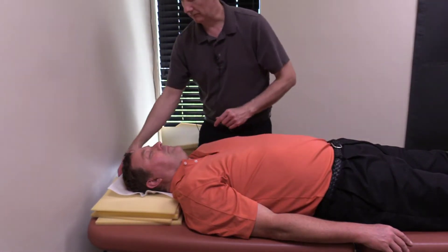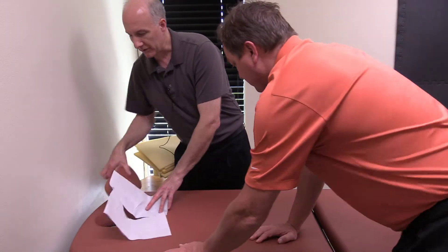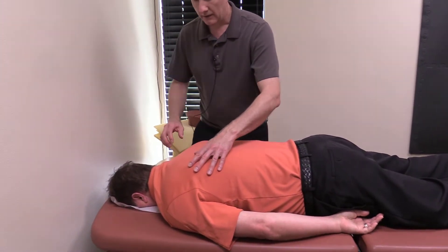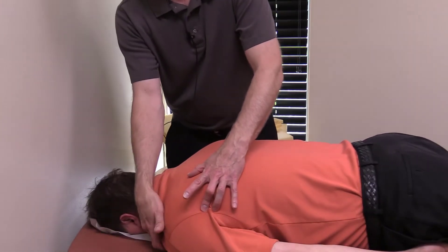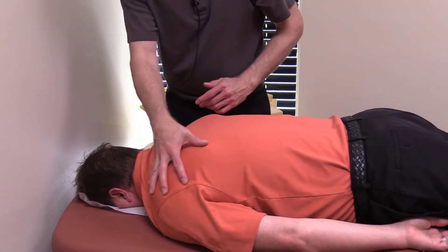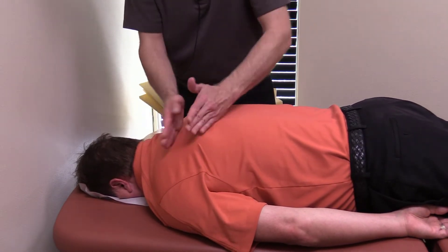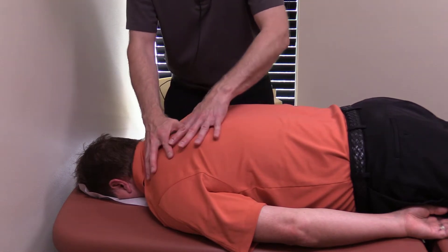Once you flip over and go face down, I'll show the other shoulder. This is the other position you can be treated in. The scapula is kind of a floating bone — there is a connection through the clavicle, but it's connected through the rhomboids. So you've got the infraspinatus through here, teres major, teres minor, the rhomboids through here, and the whole trap which covers everything.